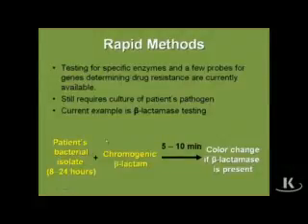We can add a chromogenic, color-changing beta-lactam, and if the organisms isolated from that patient have a beta-lactamase, it will cleave the beta-lactam and you'll get a color change. And those tests you can do in 5 to 10 minutes. So that's a relatively simple test to do.